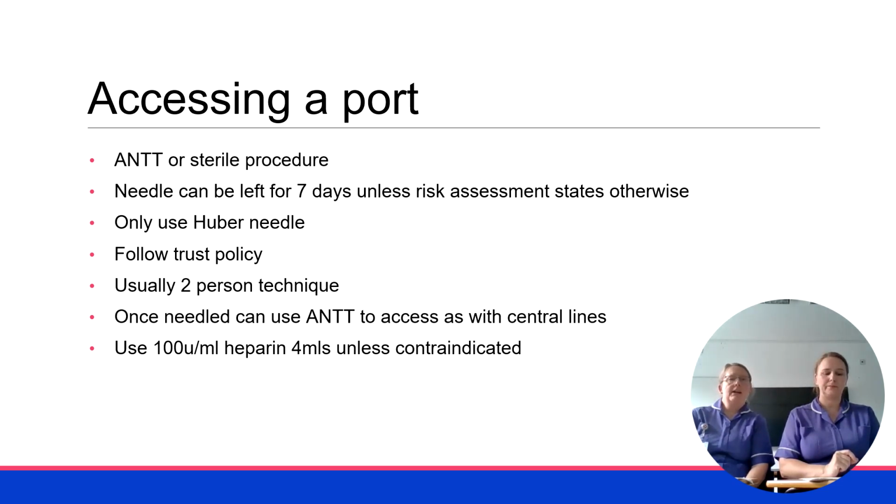So when accessing a Portacath, so when we are needling it, depending on the trust you work in, this would either be done as an ANTT process or done as a sterile procedure. Once needled, the needle can be left in for 7 days unless a risk assessment for that individual patient states otherwise. Only using Huber needles and following your local trust policy.